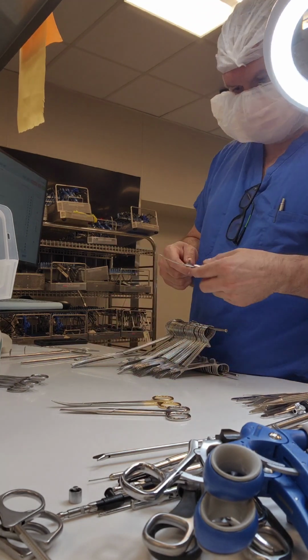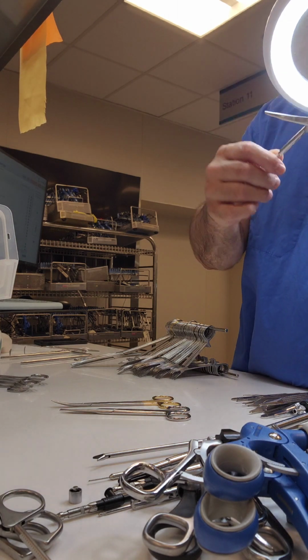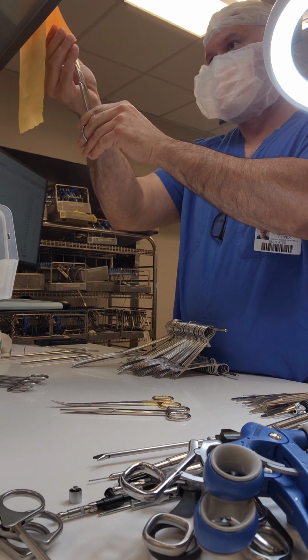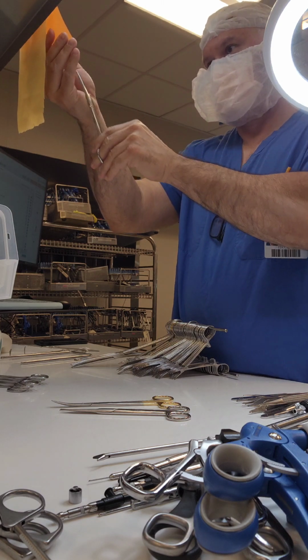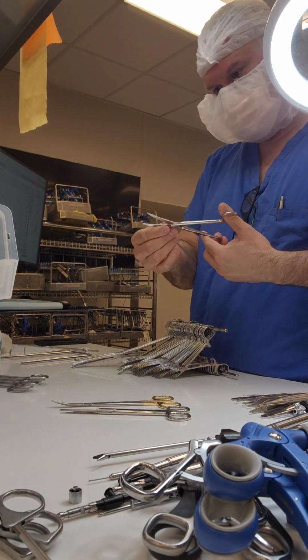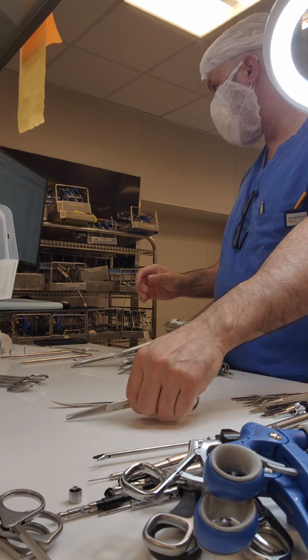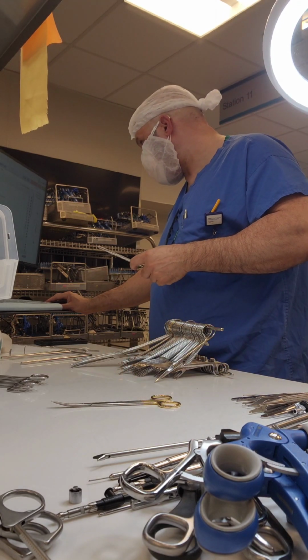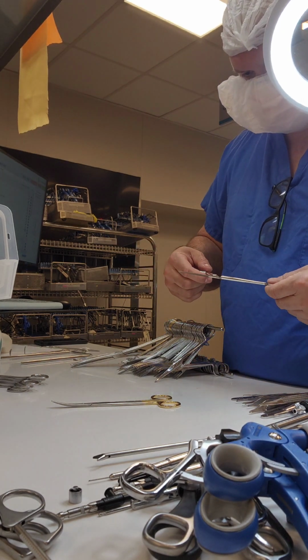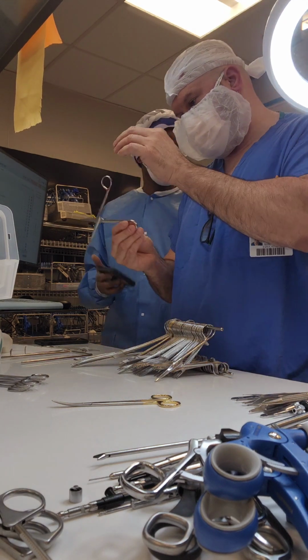Now I'm going over to, I believe these are my scissors. So your scissors, definitely that box lock. You want to do that drop test to make sure that there's some friction, and then the sharpness testing again. And when you do that sharpness testing, if there's any residual testing material on the jaws, you want to get that off of there, because that's foreign material if it's opened up in the OR. So you have to inspect the instrument yet again. Quality, guys. Quality costs time.